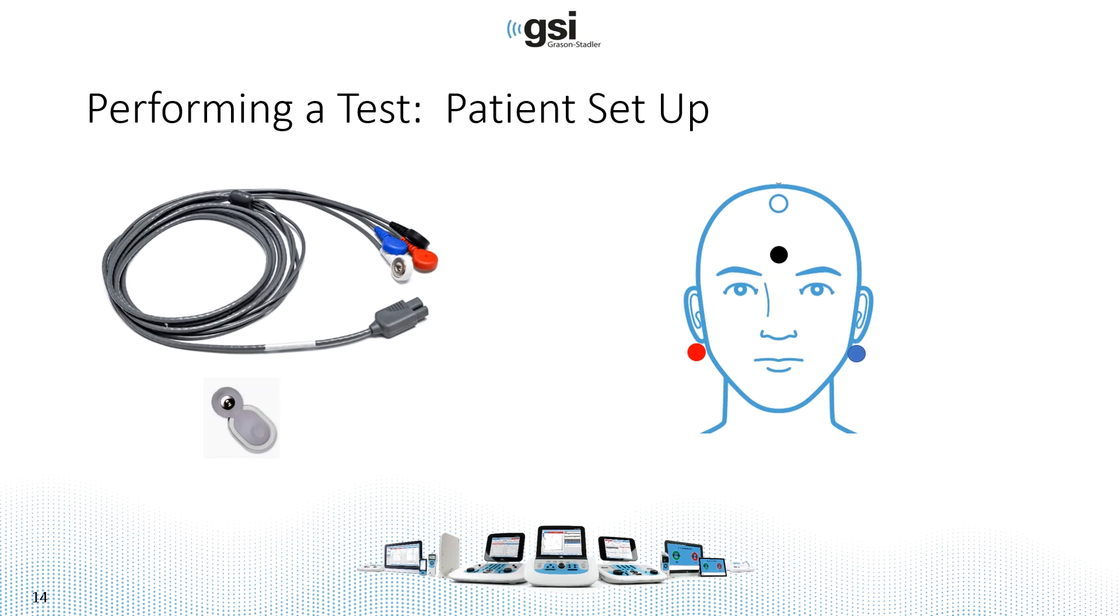the ground or black electrode on the low forehead, and then the red snap on the right ear, blue on the left ear.